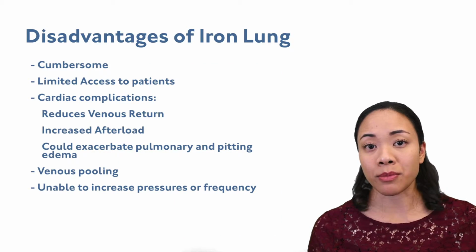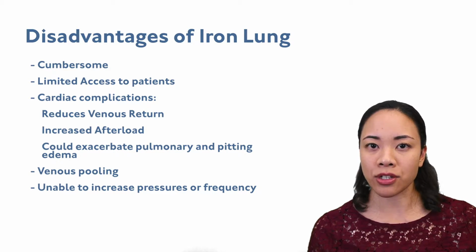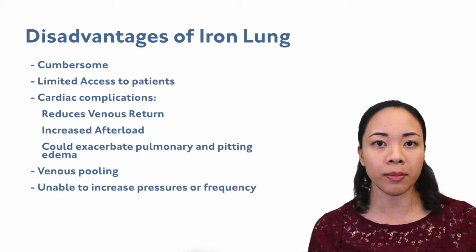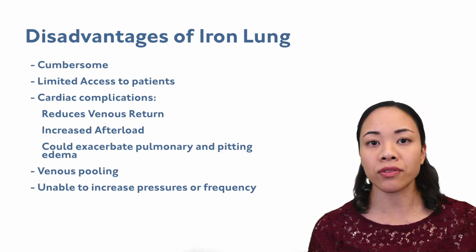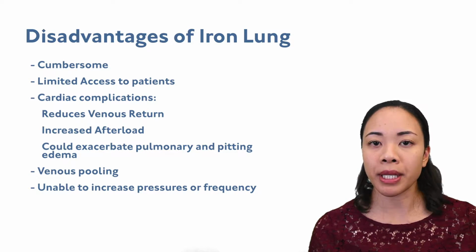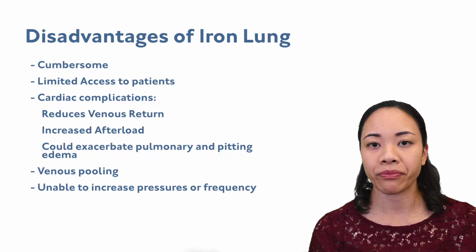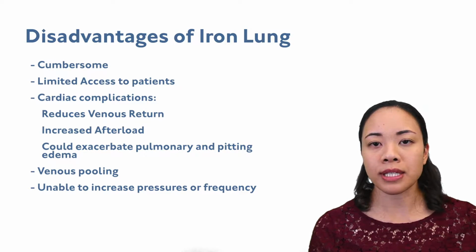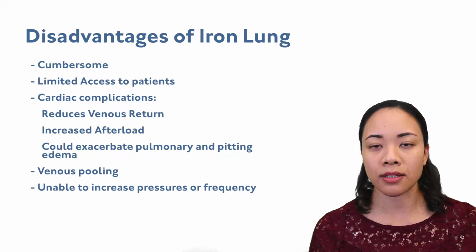It was cumbersome, so it was large and bulky. Clinicians had limited access to patients. Cardiac complications included reduced venous return, increased afterload. It also exacerbated pulmonary edema and pitting edema, which then led to venous pooling in the extremities. Another drawback was that a clinician was unable to increase pressures or frequencies for their patient.